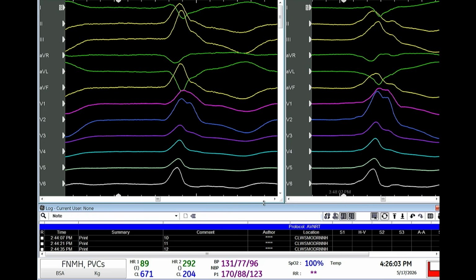And the first workflow that is going to make the decision right away into what is the next step in terms of ablation is to map the epicardial surface of the left ventricle. And that is the epicardial surface of the LV summit. Now, in the beautiful presentation today for anatomy, we saw that you cannot go epicardial for this. So we failed many years ago. So epicardial is out of the question. But what's very helpful for us is the veins, because the cardiac veins are in close relationship potentially to this area, okay? So the first step on the procedure is X-ray number 1.